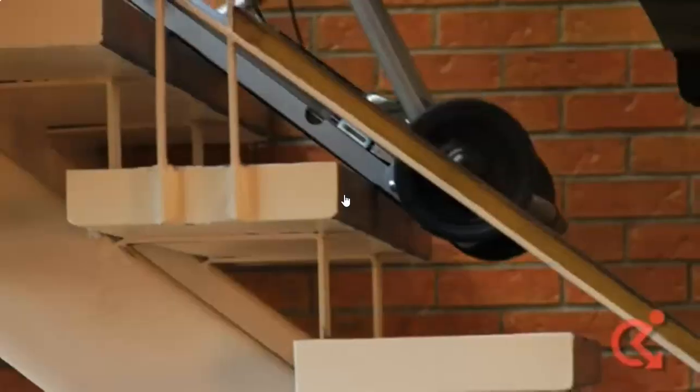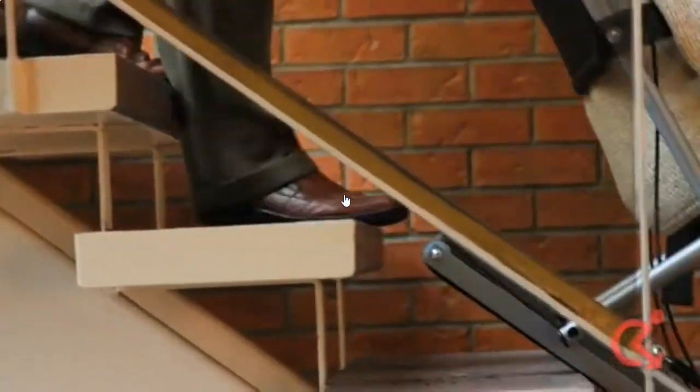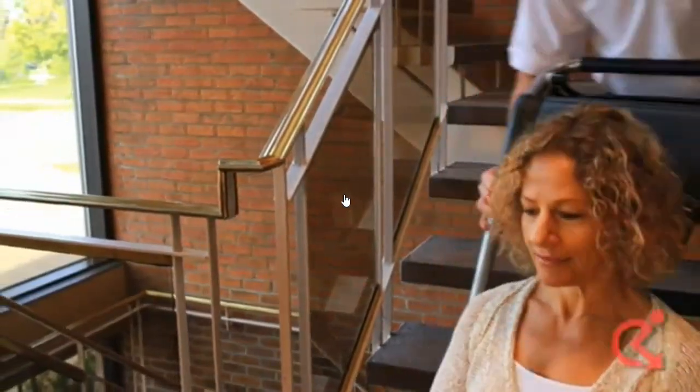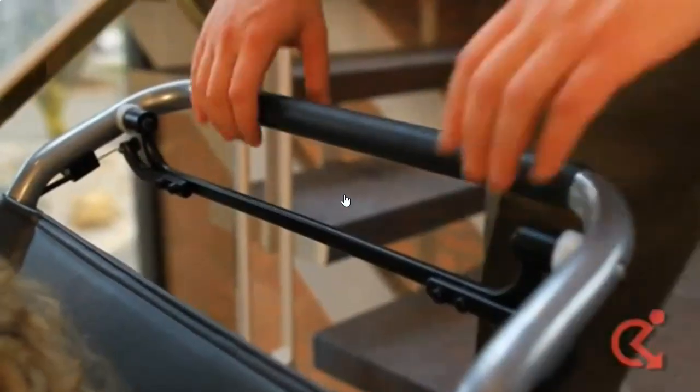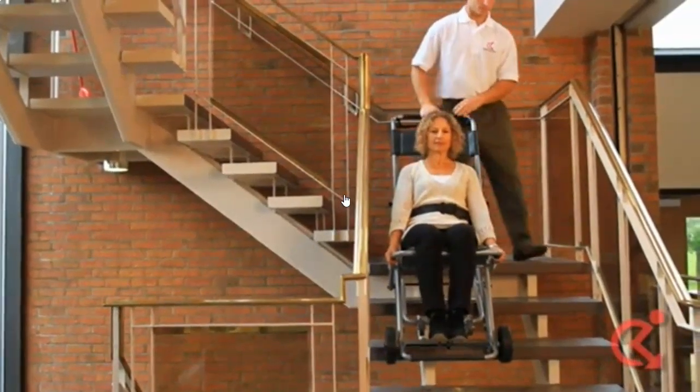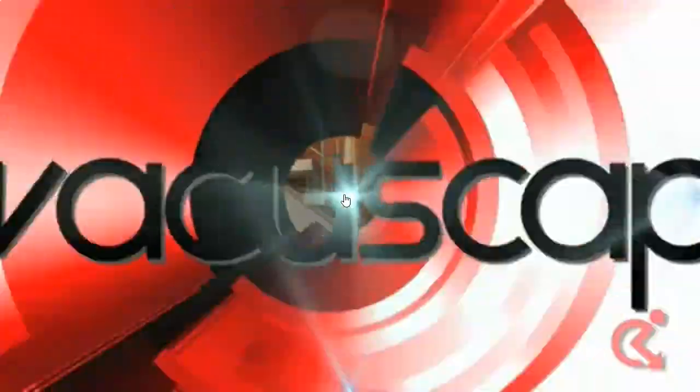Push down on the handle so the track sits firmly on the stair edges to ensure a smooth controlled descent. The friction design of the track will limit descent speed. On the EC2 model, you can also use the brake to control descent speed. Note: with the EC2 model, the brake must be pressed in order to use the chair. Letting go of the brake locks the track system in place.